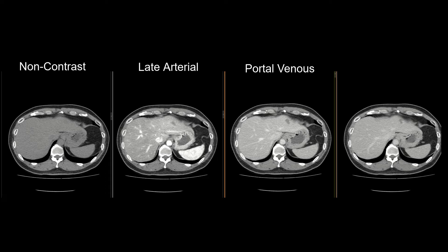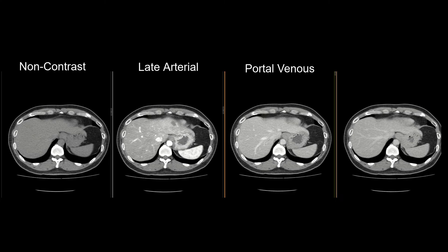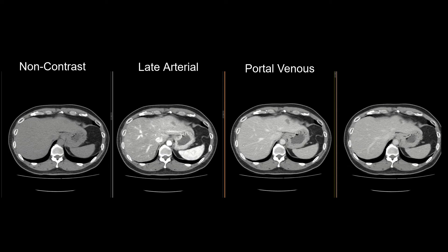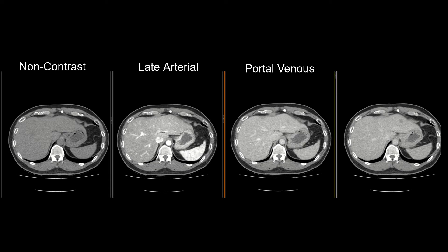Three, we have a portal venous phase acquisition around 75 seconds after injection, with the hepatic veins now opacified. The background liver is also now closer to peak enhancement — so background liver is pretty bright. Four, we have a more delayed or equilibrium phase, acquired a few minutes after injection, with contrast now moving out of the liver and the attenuation of background liver now less than on portal venous phase.